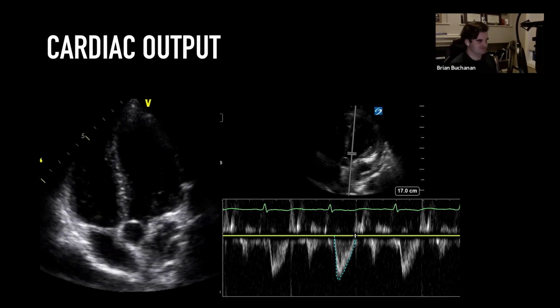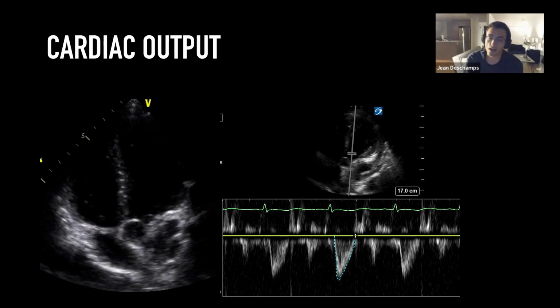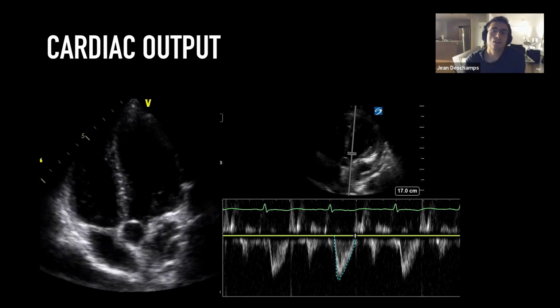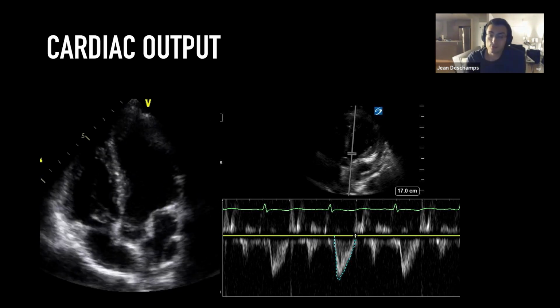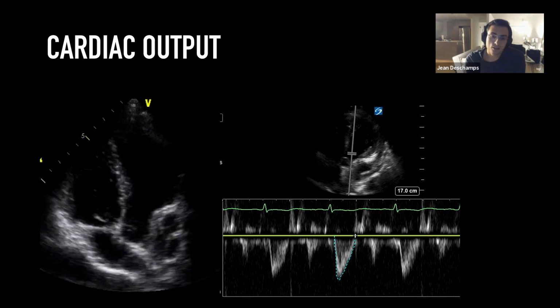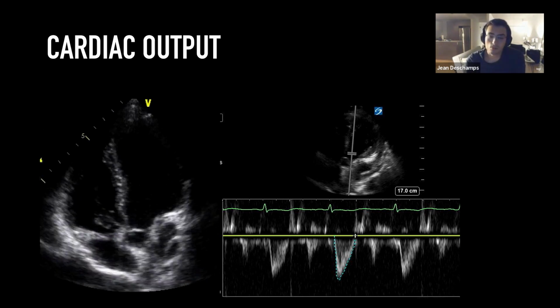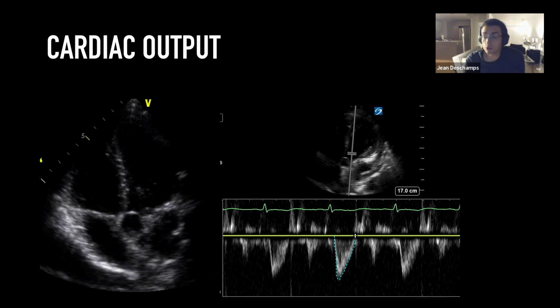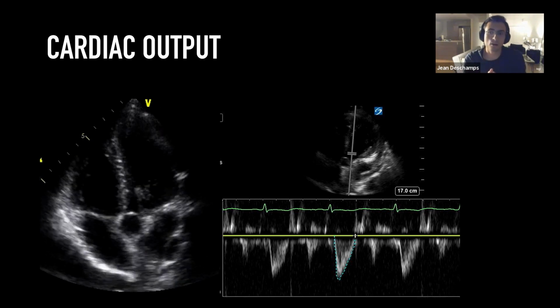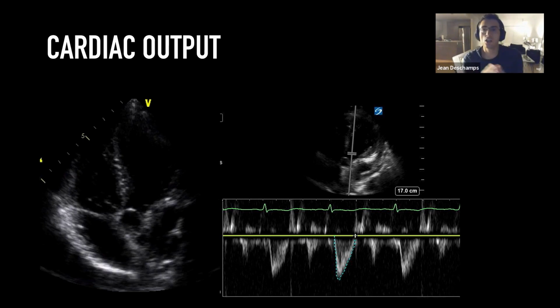One last thing I want to throw out there is looking at the evidence of where to use VTI. It's been mostly studied in sepsis in terms of volume response, to see if your VTI goes up, then you might be volume responsive. I would argue, however, that you probably should multiply by heart rate as well, because that would also change dynamically depending on the manipulations you do hemodynamically to your patient. And the product of those two might be more reflective of what your actual manipulation is doing if you're looking at a percentage change over time.